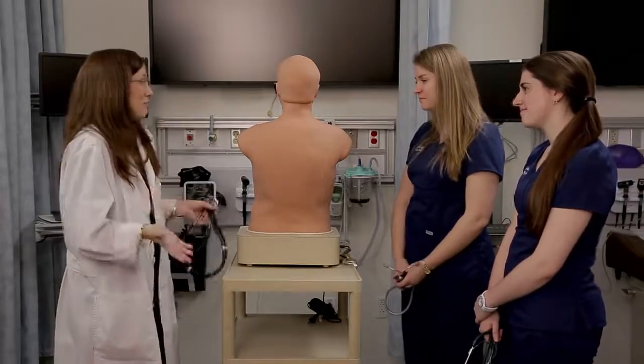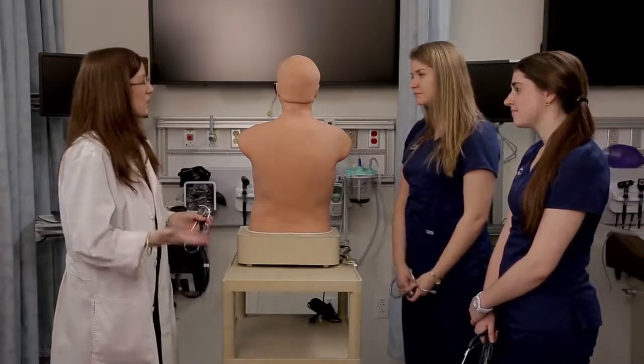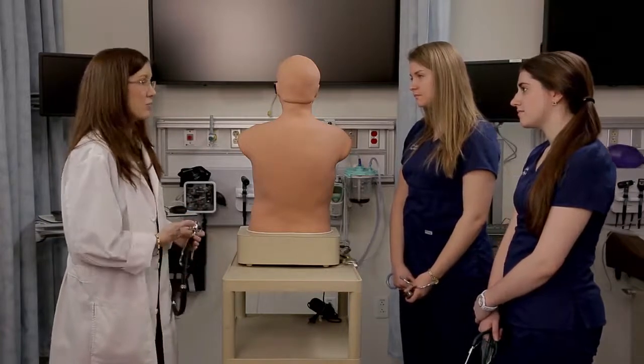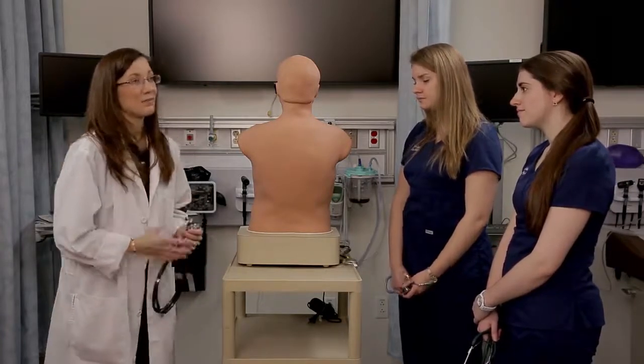So this is just a basic demonstration of what's going on when a healthcare provider listens to the lungs with a stethoscope. So that's our demonstration today, just a brief demonstration of respiratory assessment by listening to the breath sounds.